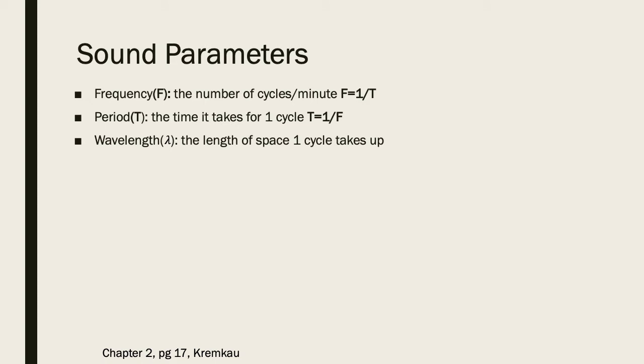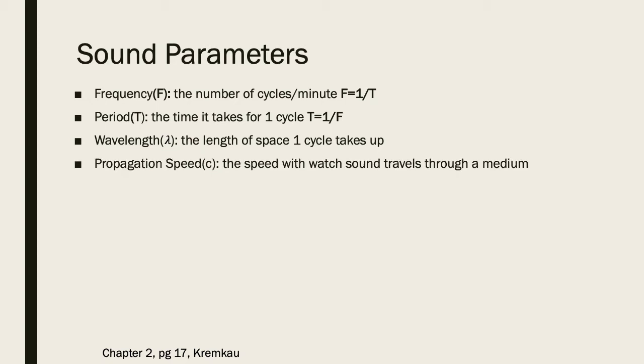The next one that we have is wavelength, and that is the length of space that one cycle takes up, which is usually measured in millimeters. And then finally, we have our propagation speed, which is the speed at which sound travels through a medium.